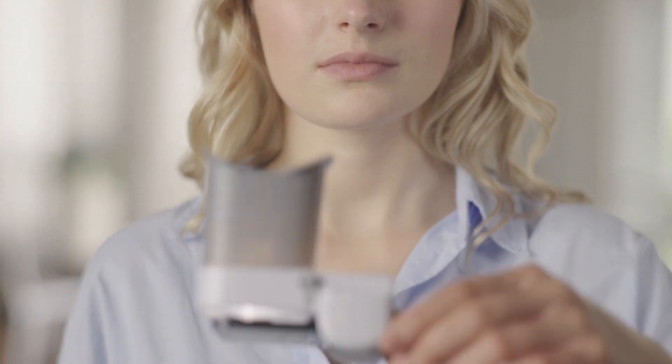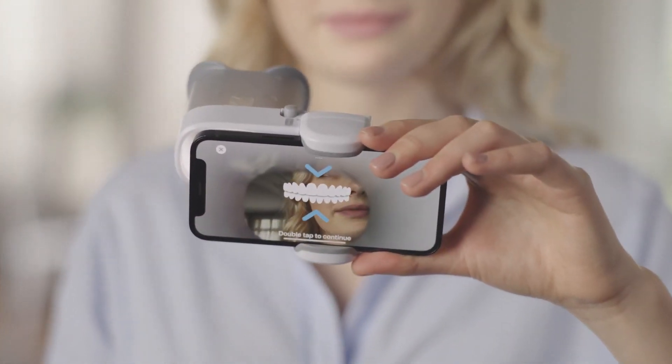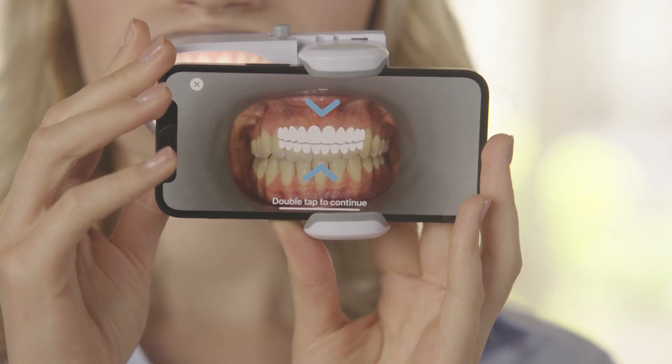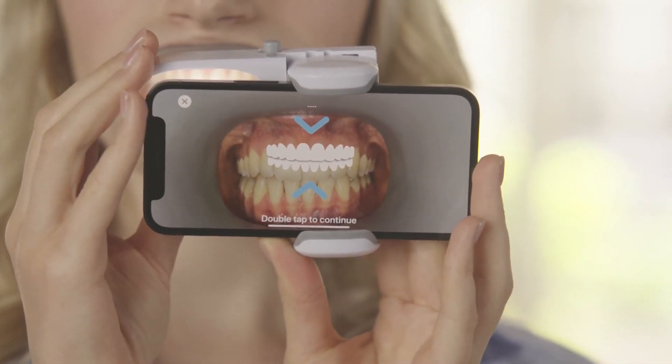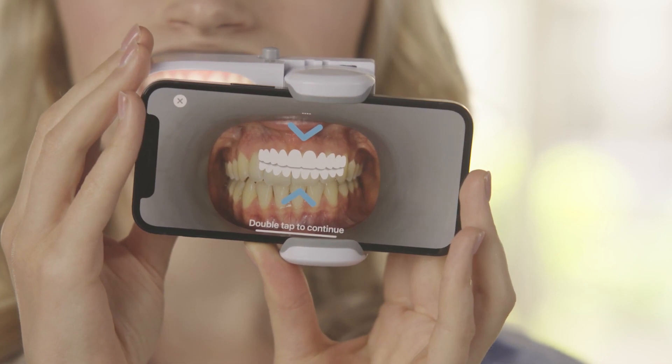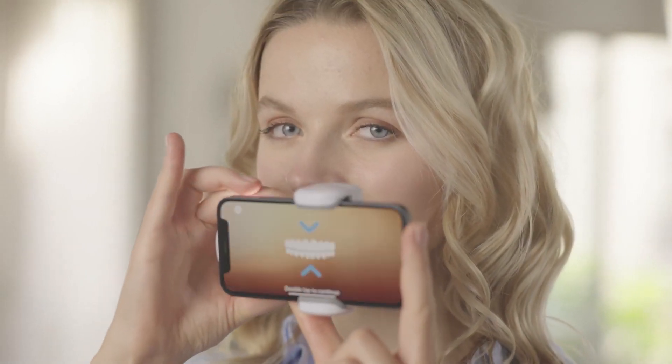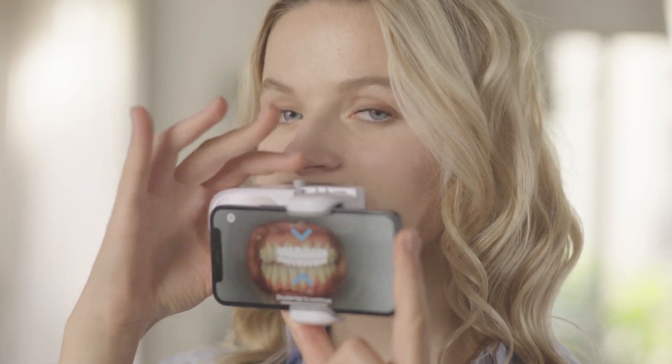Hold your scan box with one hand on the phone and the other hand holding the tube. Insert one side first, then the other. Your teeth and gums should be fully visible without causing discomfort. Make sure your teeth are in the center of the camera screen. If not, you may need to adjust the position of your phone by sliding it for vertical adjustment.